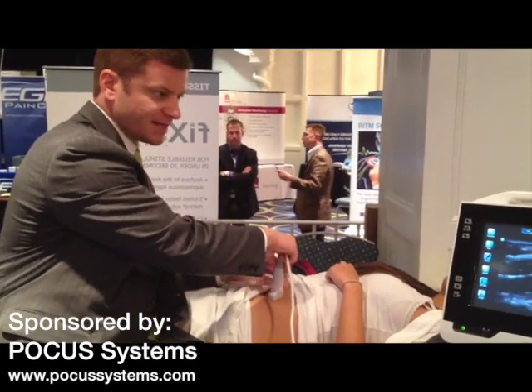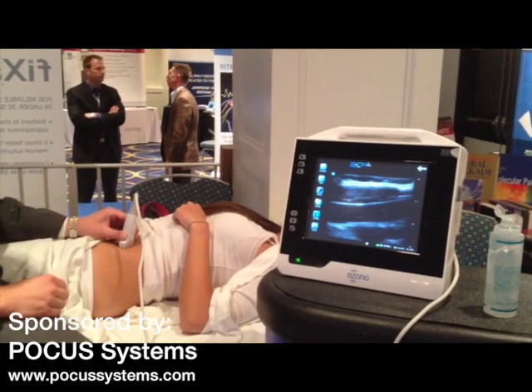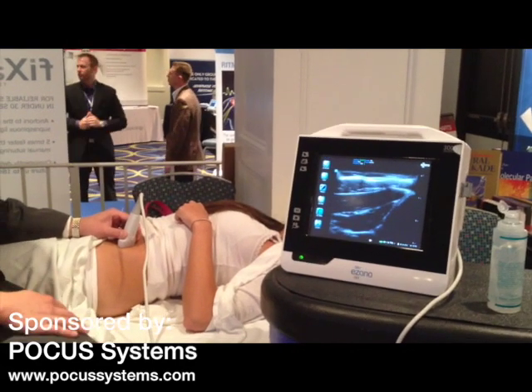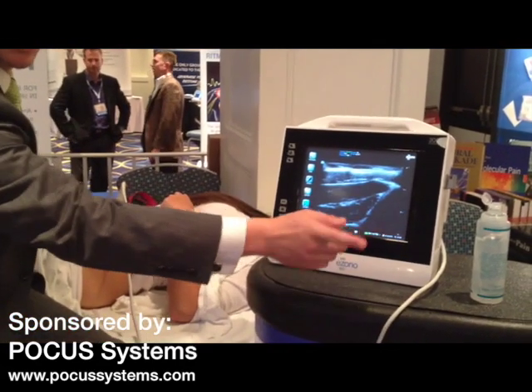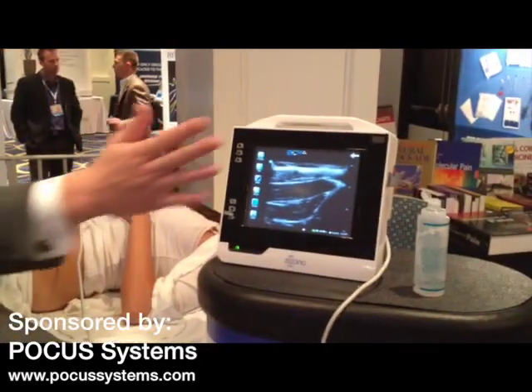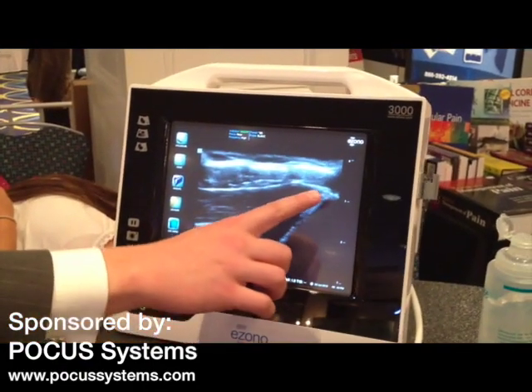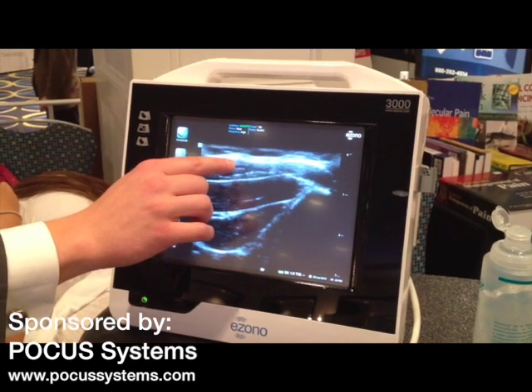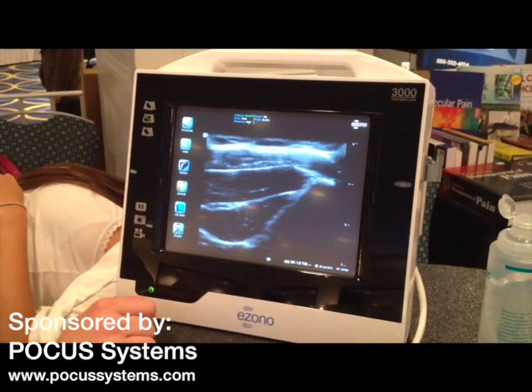If I drop my probe on this, what I'm going to see is a beautiful image of the three muscle bellies that I want to visualize. You can see them here. Let me point out the structures. The three structures we're seeing here — I see three muscle bodies. This is the external oblique, the internal oblique, and the transverse abdominus.